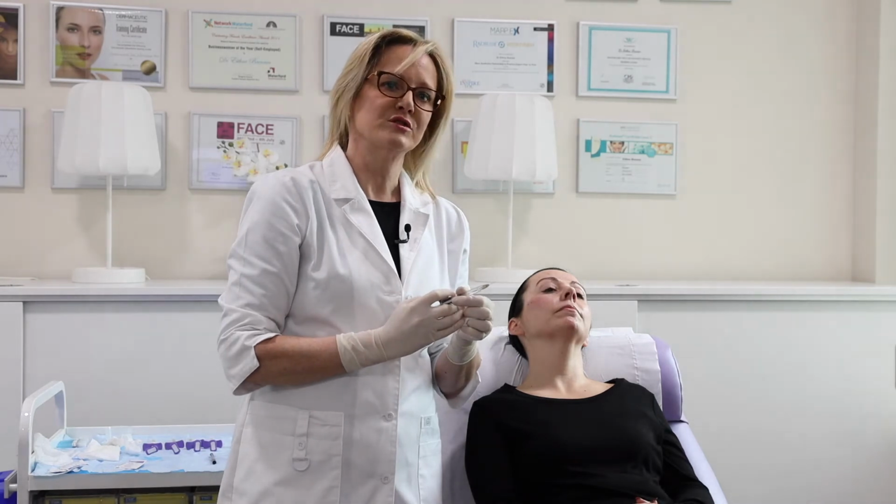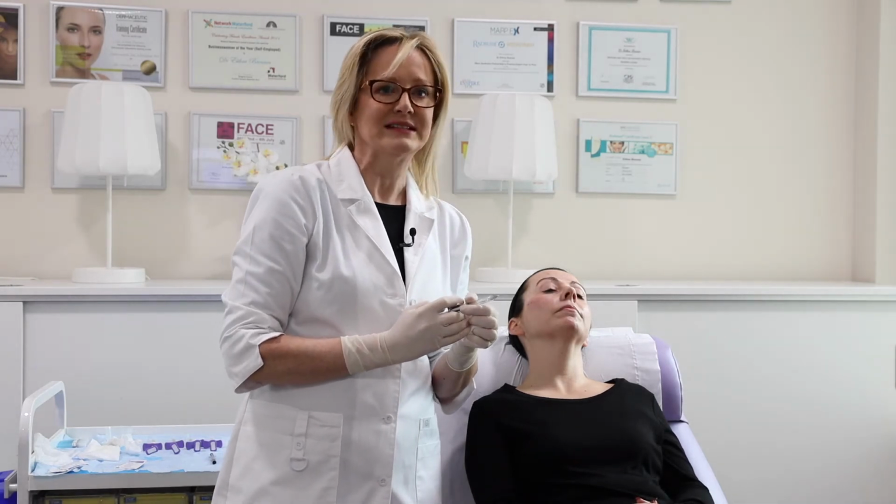I'm also going to do a small bolus of 0.2 cc's in CK2, particularly here on the right side because our patient is asymmetrical and I want to get a little more lift on the right hand side. I'm going to again be supraperiosteal, and I'm going to aspirate and be very cautious with this. In some patients with a very well projected CK2 you may not need to use some Voluma here, but for my patient I will be doing it.